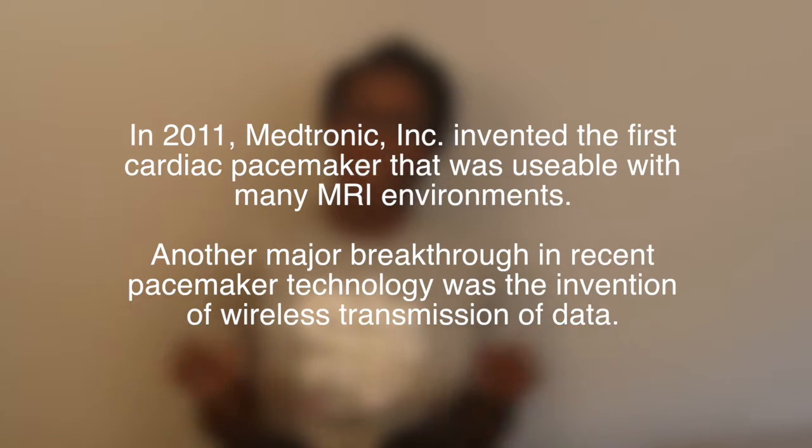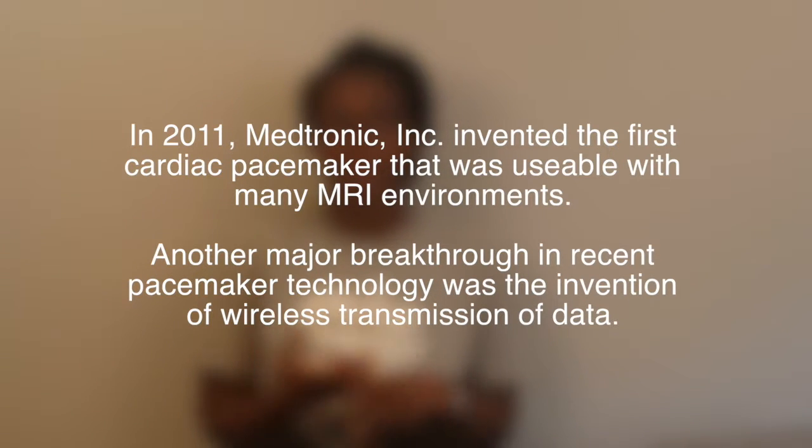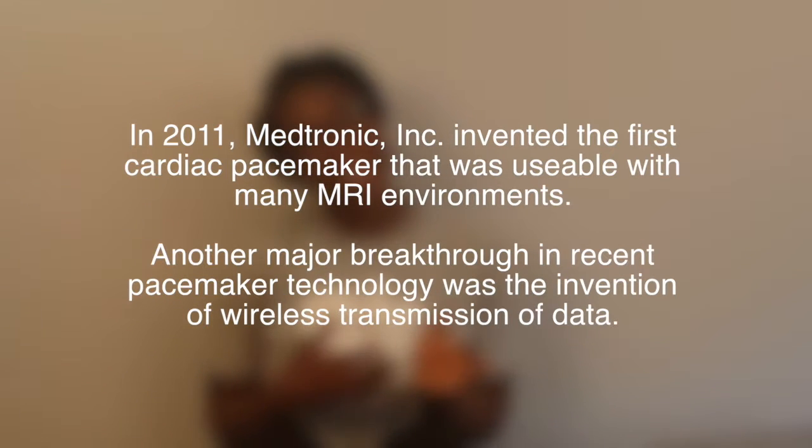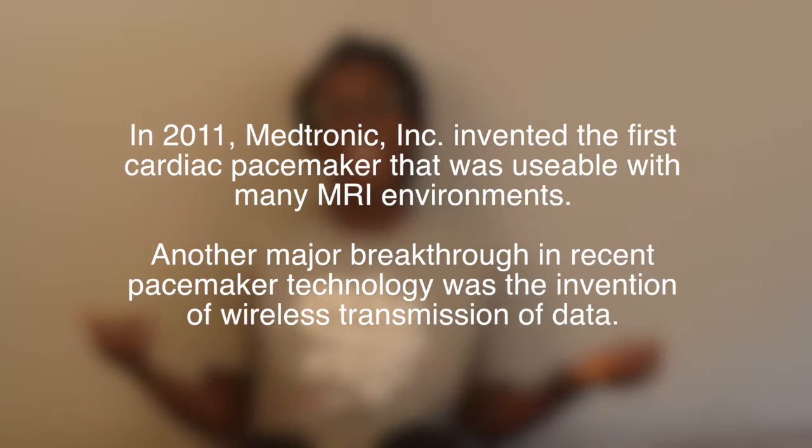And until now, pacemaker patients were unable to undergo MRI diagnostics of medical conditions. Another major breakthrough in this specific field is the invention of a wireless transmission of data collected by the pacemaker directly to the clinician without patient interaction.